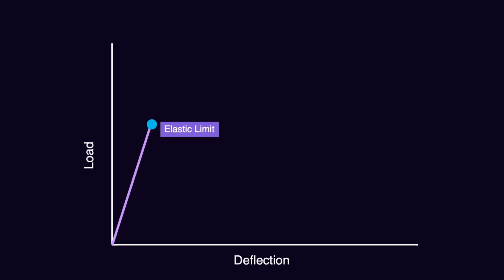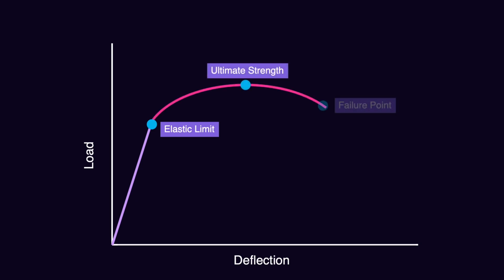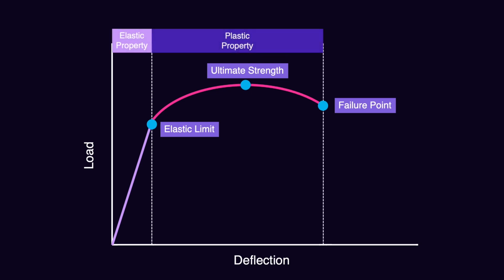after which the material does not go back to original position. That point is the elastic limit of that material. After that, the permanent deformation appears. If I increase my force, the permanent deformation increases. So as we discussed before, the clinical application of the wire is at this elastic limit or early stage of this plastic range. If permanent deformation increases significantly, the wire does not go back to its original position and therefore clinical usage of it decreases significantly.